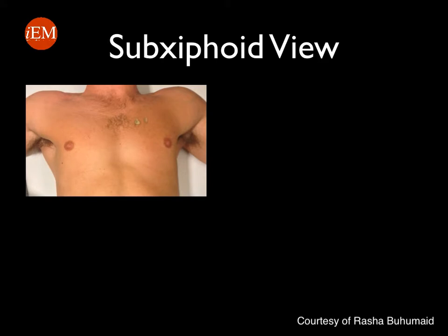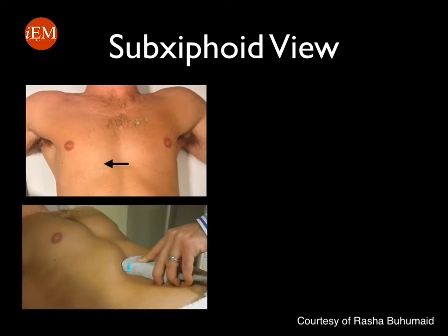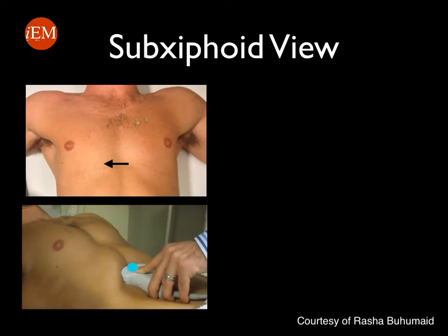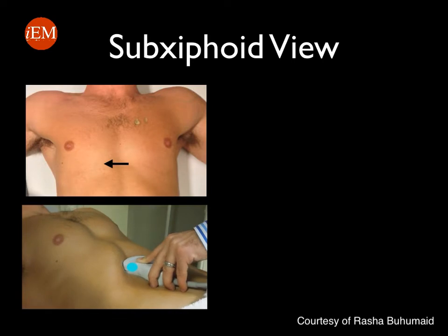First, the sub-xiphoid view. Your anatomical landmark for the sub-xiphoid view is the xiphoid process. You will place the probe just below the xiphoid process and the probe marker will be pointing towards the patient's right. Note that the sonographer is placing the probe very flat, angling it towards the liver to obtain this view.